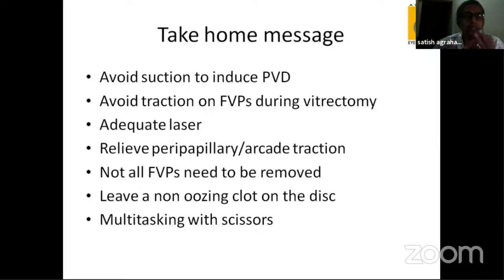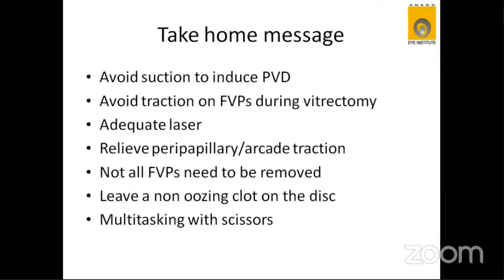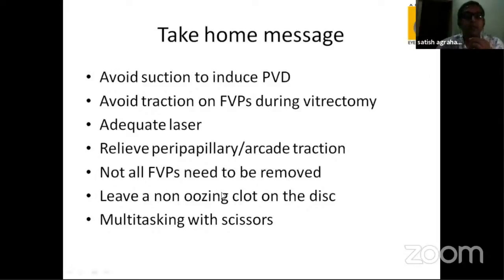Please, at the end of the surgery, do not forget to finish off the laser, because nowadays a lot of people try to hurry up, put an endolaser, put a tamponade and just close it off. I think adequate laser is a must at the end of our surgery. And relieve the peripapillary traction and arcade traction to the extent possible.